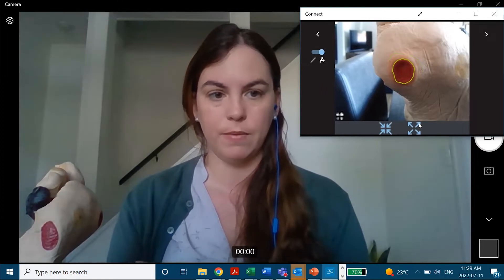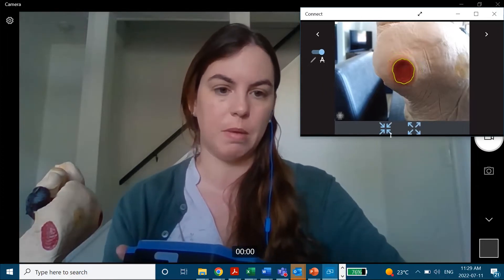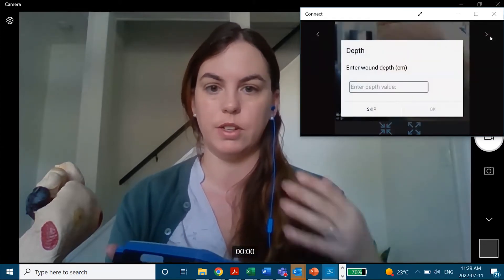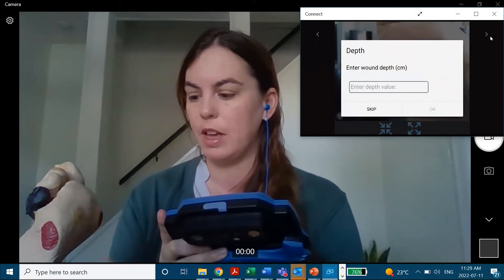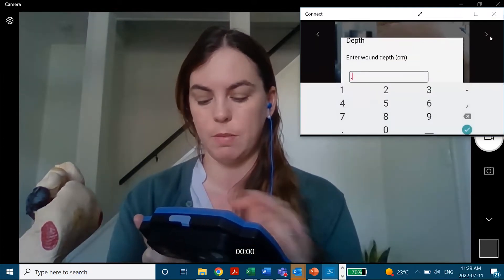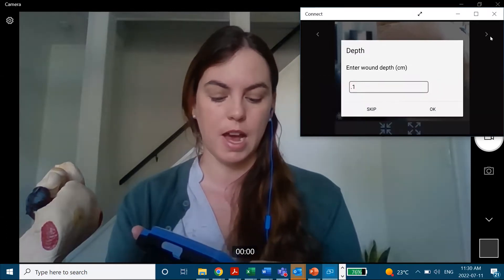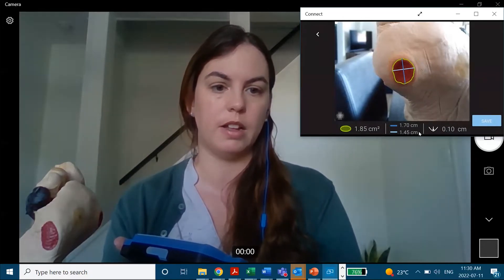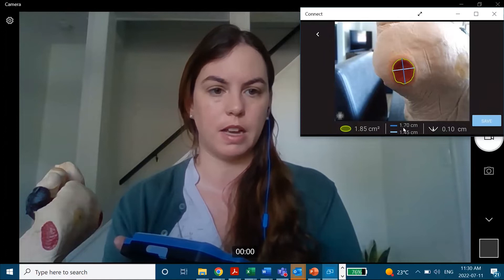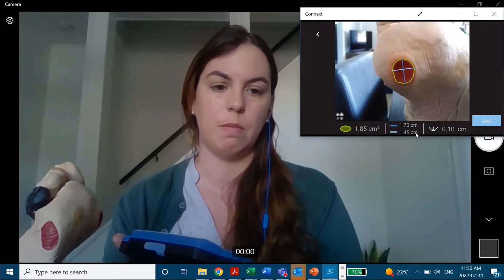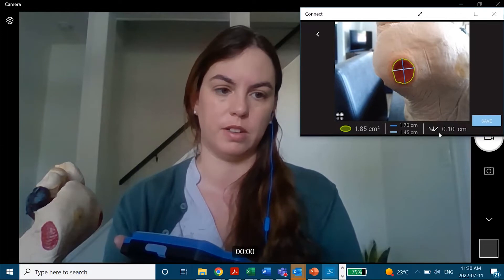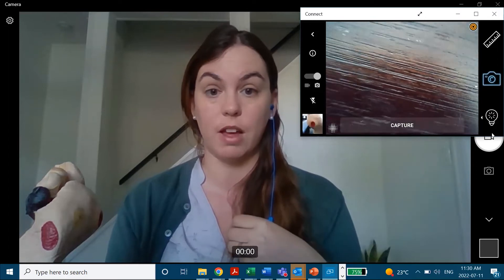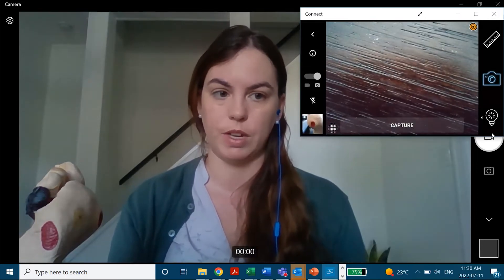This will find my wound border for me. I can adjust it if needed by making it bigger or smaller. By tapping the forward arrow, it's going to take me on to enter manually measured depth. Let's say it's 0.1 centimeters — I'll enter that. And at the end I have my measurement image. I've got a surface area in green, my longest length in dark blue, my width in light blue, and then my entered depth. I'm going to save that, and that's going to save right into that patient file and add a new point to the wound area graph.